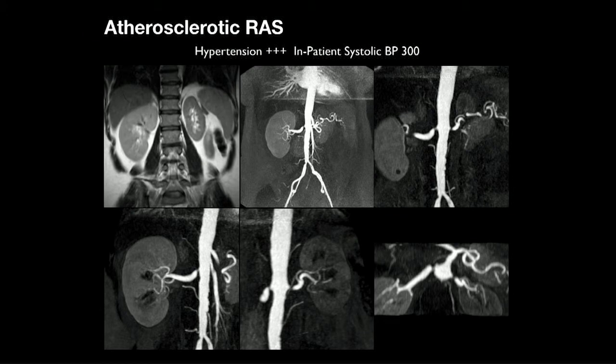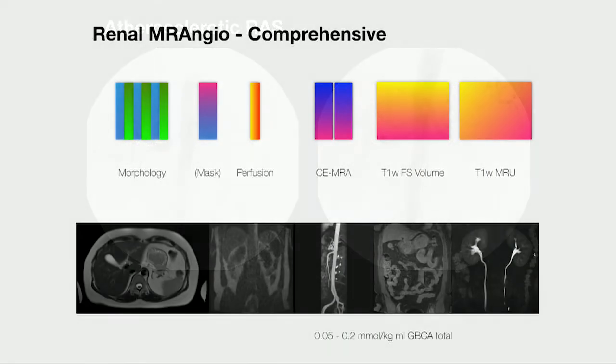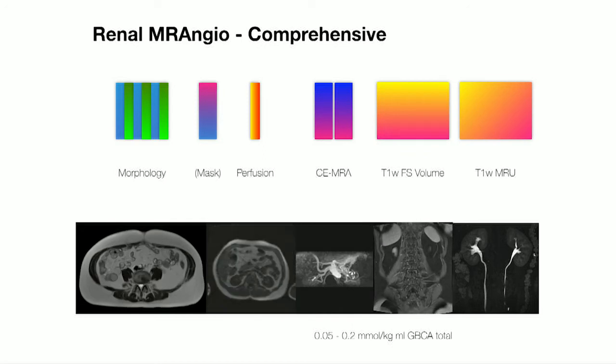So I took her to the lab, and she had bilateral renal artery stenosis. Because I'd done the MRA, I knew exactly what angle I needed for my C-arm in order to profile the renal artery ostia, and I put in some renal artery stents, and her blood pressure came down on the table. She said, I feel very funny, doctor, and she had this kind of flushing sensation, and her blood pressure came right down. And it's been down ever since. She's still under follow-up under one of my clinical colleagues.